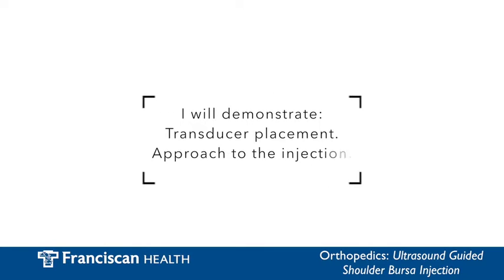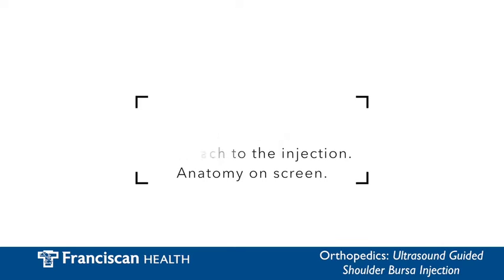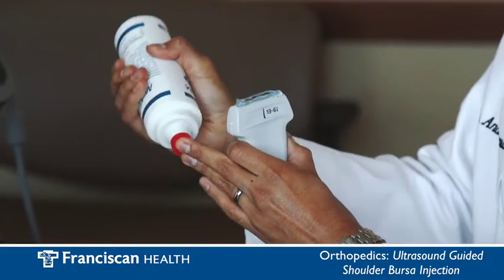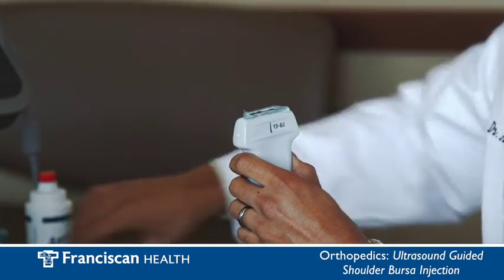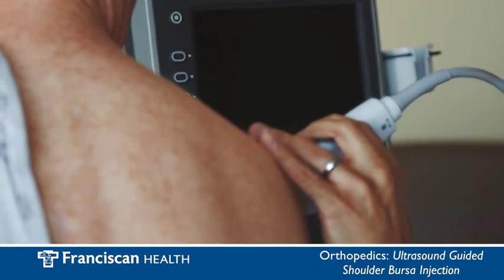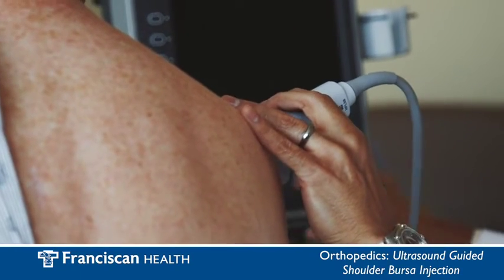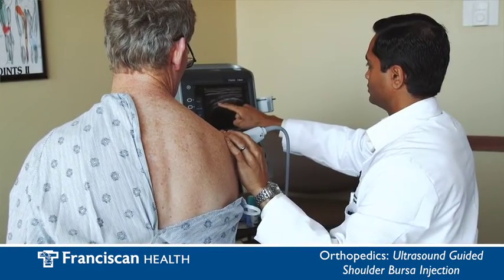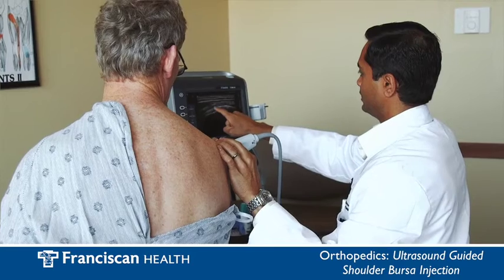I will demonstrate transducer placement, the approach to the injection, and anatomy that would be injected which will be viewed on the ultrasound screen. Ultrasound gel is applied to the transducer pad and then placed on the outside of the shoulder. Once the desired anatomy is visible I will then keep the transducer in a stable position. On the screen you can see the subacromial subdeltoid bursa.